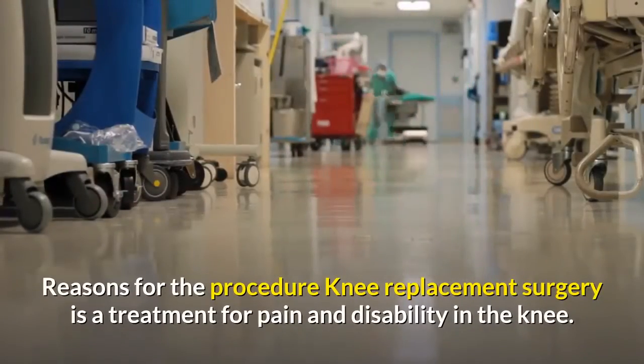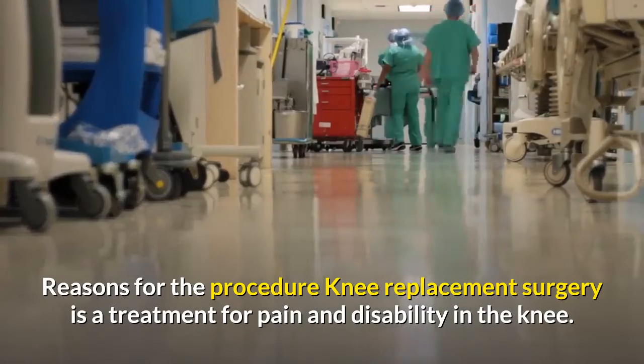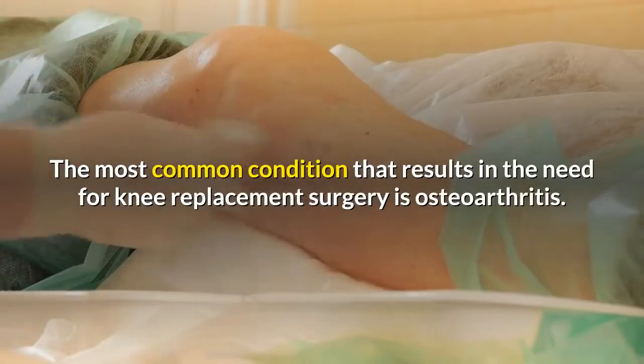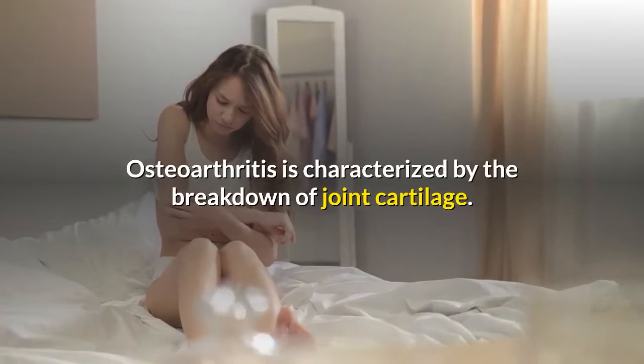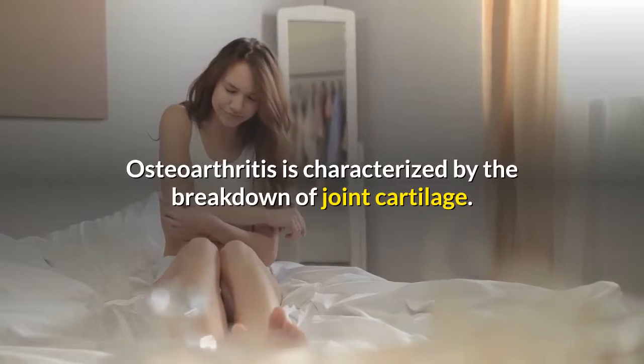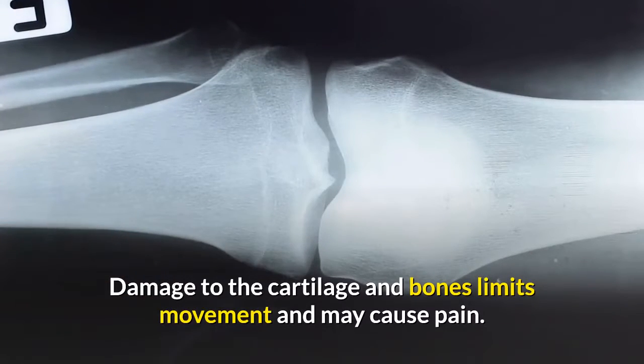Reasons for the procedure: knee replacement surgery is a treatment for pain and disability in the knee. The most common condition that results in the need for knee replacement surgery is osteoarthritis. Osteoarthritis is characterized by the breakdown of joint cartilage. Damage to the cartilage and bones limits movement and may cause pain.